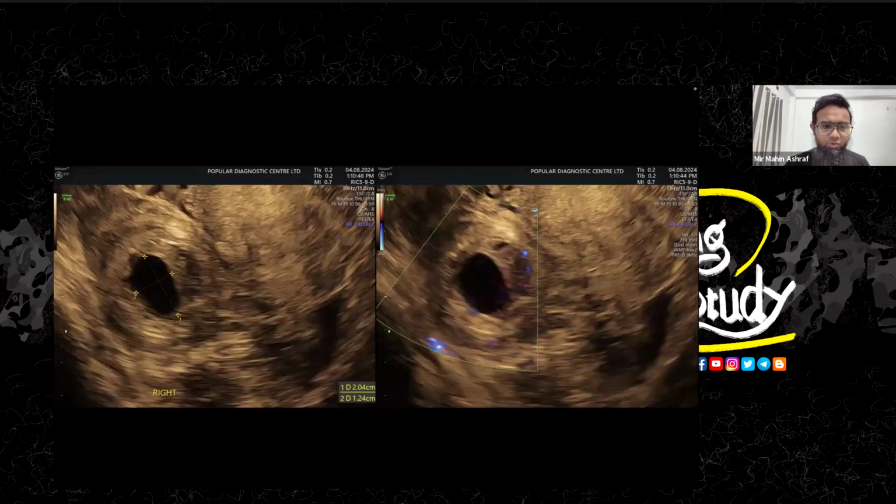So we did a TVS in this patient because we told the patient to go for a good bladder filled situation, but the patient suddenly vomited a lot, and she doesn't look quite good. So we advised her to go for the transvaginal ultrasound, and she agreed with us.